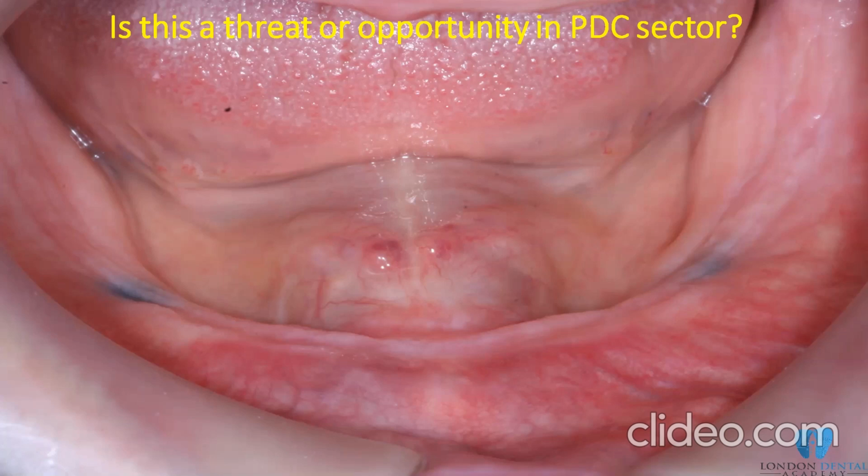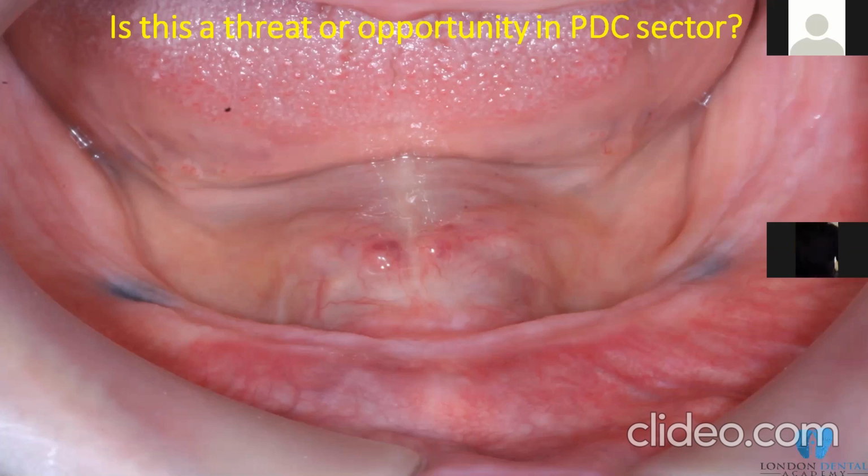The tongue is pushing all the impression material, the stock trays, the special trays, and the dentures, of course, will be dislodged immediately once fitted. But healthy keratinized mucosa cases are quite nice to look at and to treat whenever you come across them.